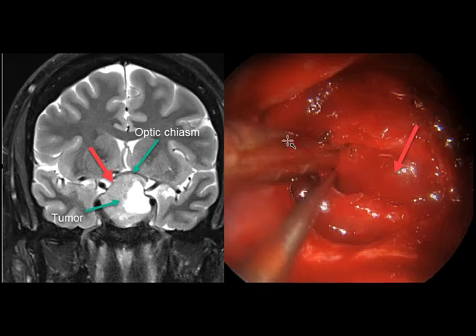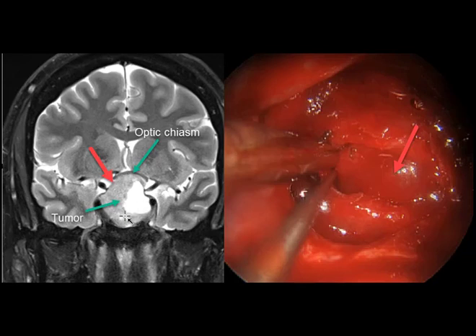This is an endoscopic view here. The tumor has been removed, and this is a membrane called the diaphragm. The membrane sits on top of the tumor, and once the tumor is removed, it descends into the field of view. For a large tumor like this, it's important to be able to look around the crevices within the sella at any persistent tumor. It's very difficult to do this with the microscopic approach.